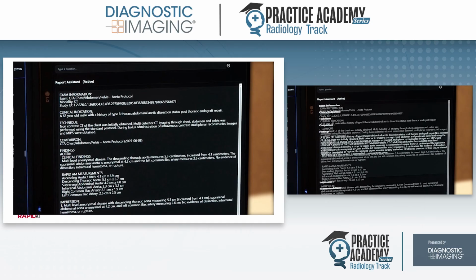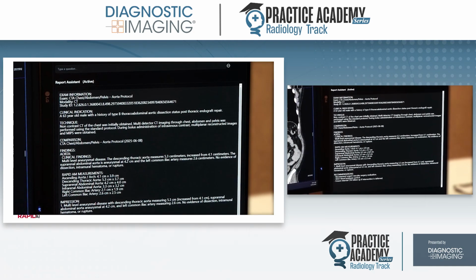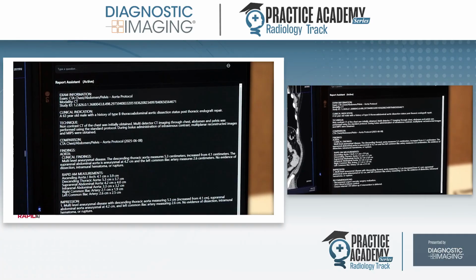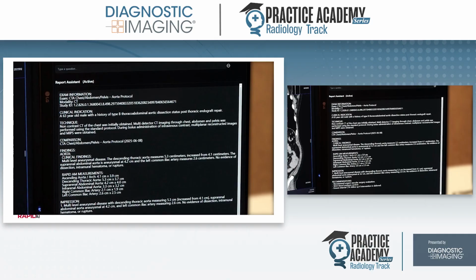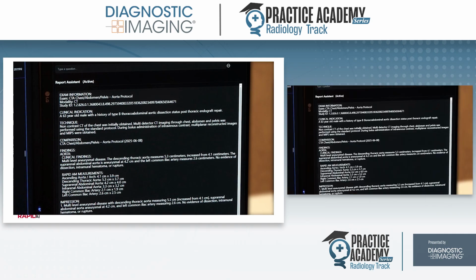Generate report. So in this case now it creates a preliminary report that has all of the information filled in with the various different sections of the report template automatically, just based upon me speaking freely about what I was looking at while viewing the images, and the information that the various agents collected from the prior reports, the history of the patient from the EHR, and the various guidelines and other information available for that particular patient. At this point, I can send this preliminary report into the reporting system where the physician can then finalize it and complete the patient.